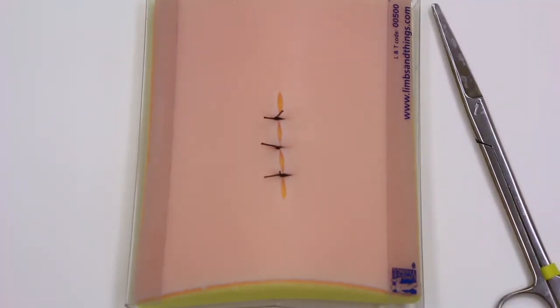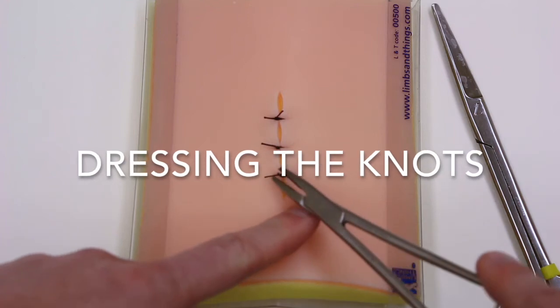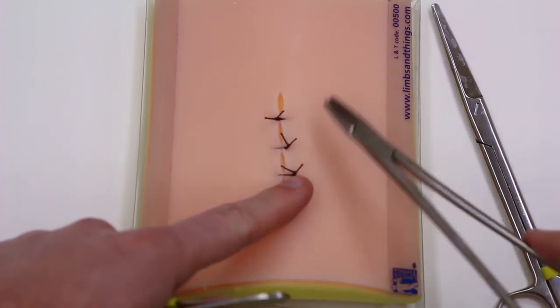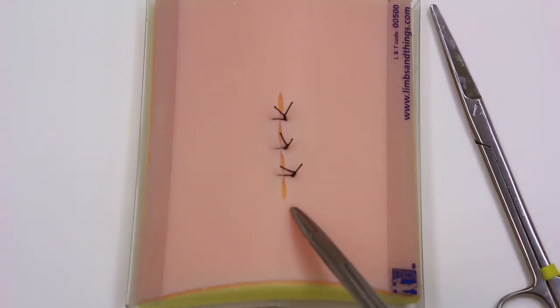So just a few more pointers to think about when you're doing this. You're going to have to take these out someday. So be kind to yourself and to your patient. Pull your knots off to one side. You do not want the knots hanging out in the middle, because this is going to get all scabbed and crusty.